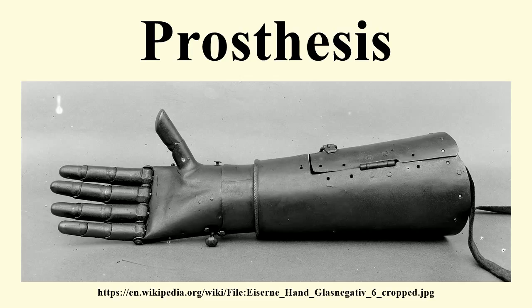The first microprocessor-controlled prosthetic knees became available in the early 1990s. The Intelligent Prosthesis was the first commercially available microprocessor-controlled prosthetic knee. It was released by Chas. A. Blatchford & Sons, Limited, of Great Britain, in 1993 and made walking with the prosthesis feel and look more natural. An improved version was released in 1995 by the name Intelligent Prosthesis Plus.